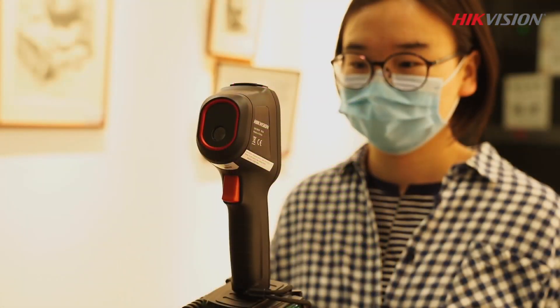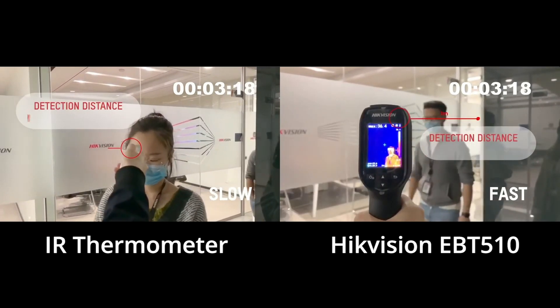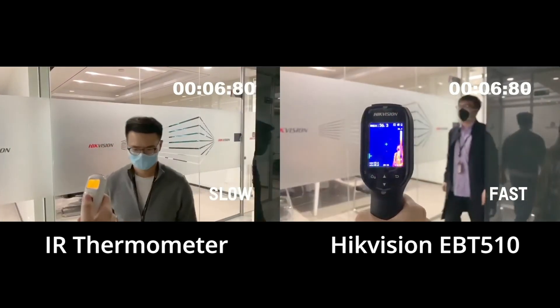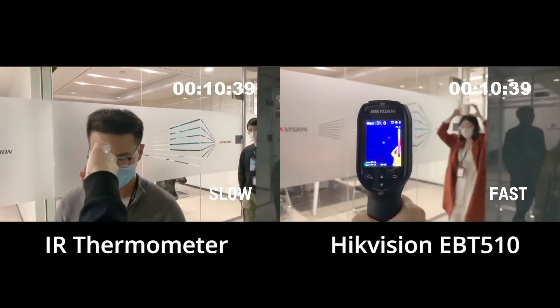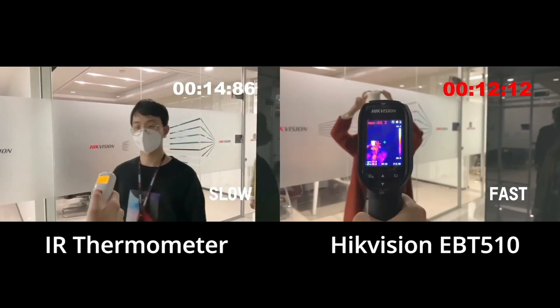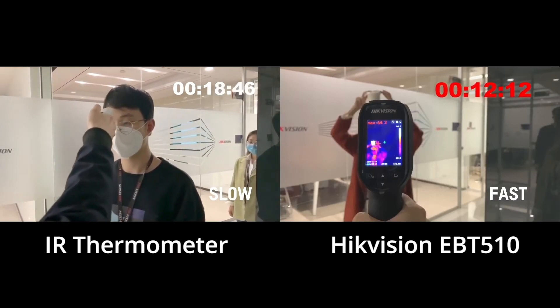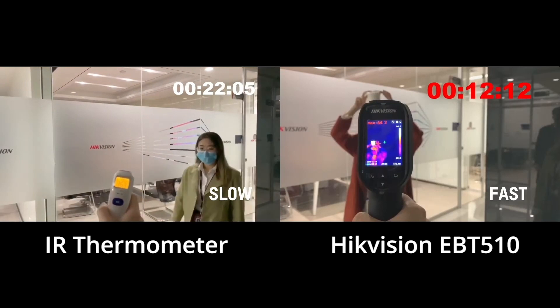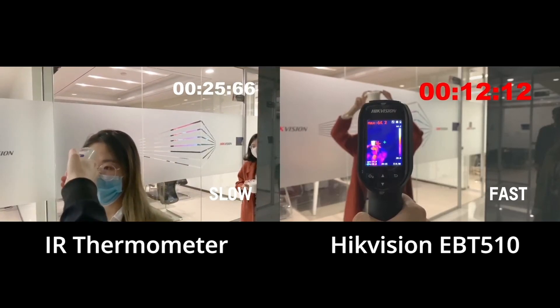The EBT-510 has a few big advantages over non-contact infrared thermometers. In this example, you can clearly see that the EBT-510 allows for much faster screening times than an infrared thermometer. It only took 12 seconds to scan 5 people with the EBT-510. You can also see that with an infrared thermometer, subjects must be within a few inches of the tool for readings to be taken.